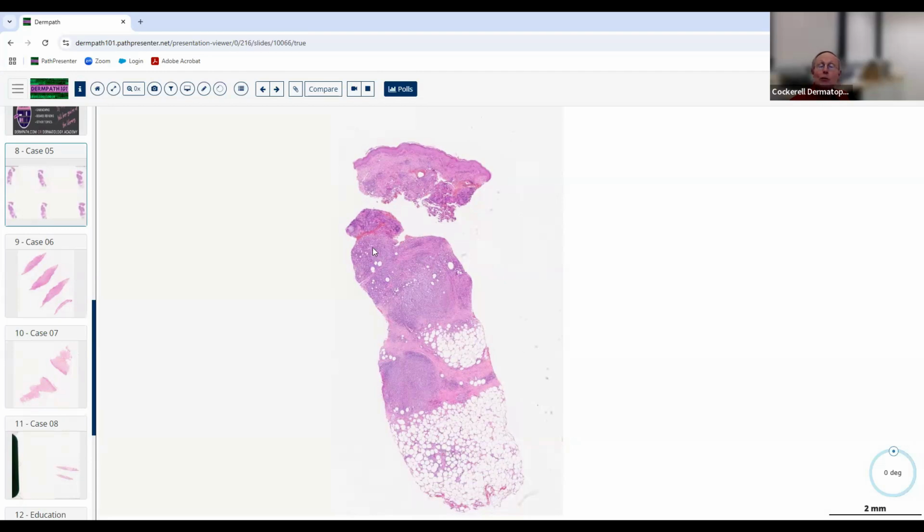But what's the pattern in the dermis that we're looking at here? Like what kind of cells are involved? Well, just the pattern. We'll talk about the cells in a second. But what's the pattern that we're looking at here? Like granulomatous inflammation? Well, that's not really a pattern per se, right? We talk about the 9 patterns of inflammatory skin diseases, and of course granulomatous inflammation can give you a lot of different patterns, right? 5 patterns primarily. We won't go through those right now. But what pattern would we call this?